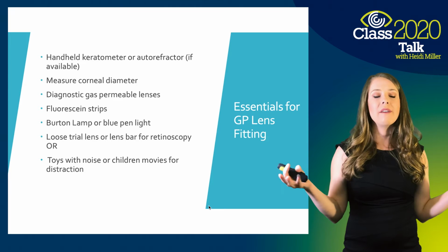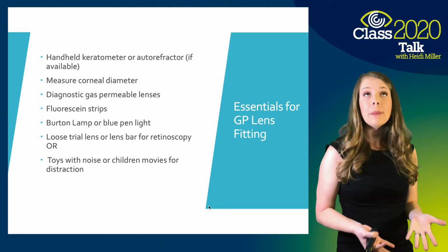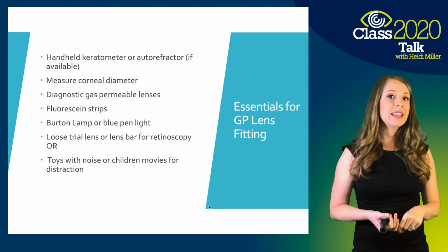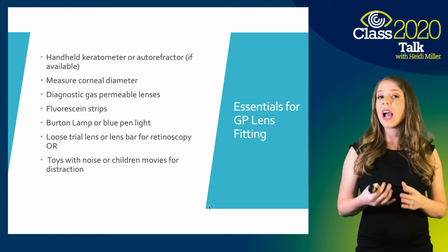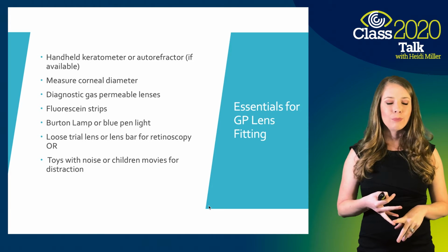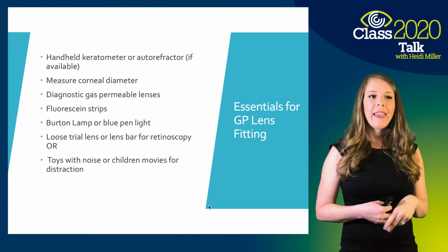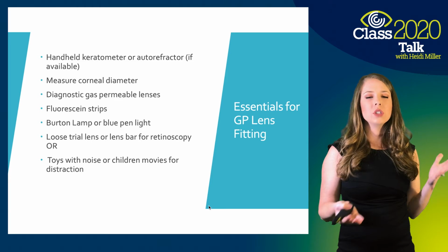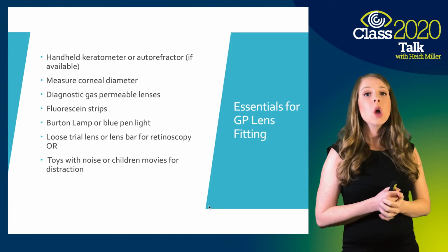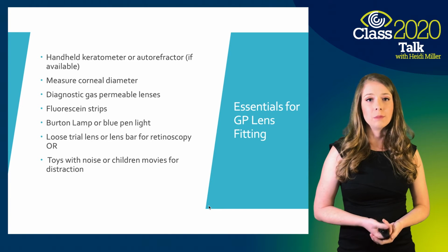And you want to have them in open space, to help make sure that you're doing some control of their accommodation. And I always recommend having some sort of toys that have noise or some sort of child movie on your digital screen so that you can distract them. A lot of times in the beginning, patients come with 2 parents. And so it's nice because the child's comfortable with both parents. One of them can be the distractor for me while I'm doing retinoscopy, and the other parent can hold the child in the exam chair.